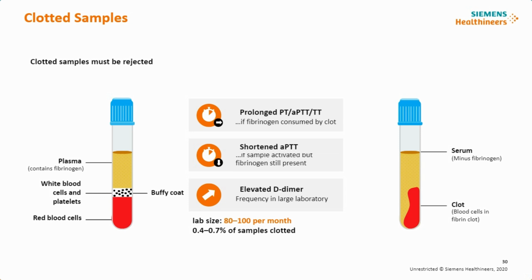So it's another good example of looking at those microclots or microfibrin strands. So oftentimes laboratories now will take one of those wooden applicator sticks and gently look at the plasma to see whether or not there are any fibrin strands. That could indicate a clotted specimen. So if a clotted specimen is spotted, of course, it should be rejected and asked for a redraw.